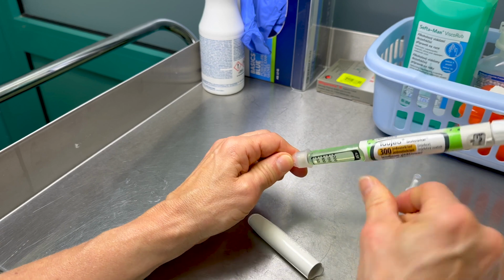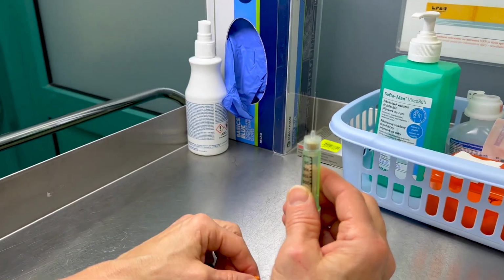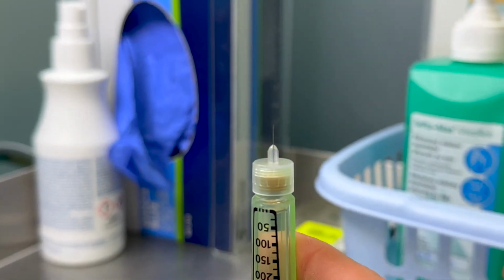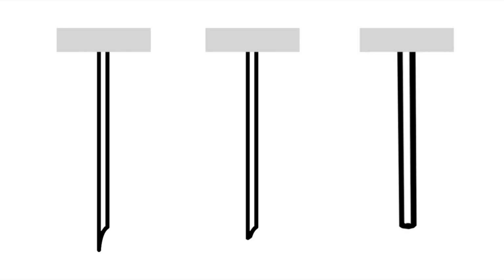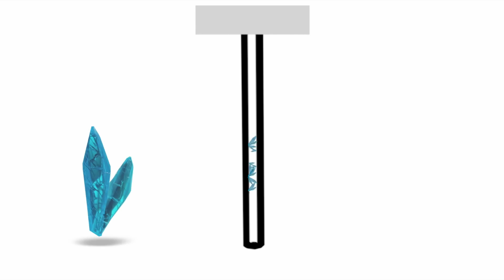Reusing needles carries several risks. After the first use, the needle becomes partially dull, making the injection more painful and increasing the risk of small injuries, bruises, and damage to the subcutaneous tissue. Injecting into hardened tissue can affect insulin absorption, leading to unexplained fluctuations in blood glucose levels. In such cases, it becomes difficult to calculate the insulin dose's effectiveness. Insulin may also crystallize inside the needle, potentially blocking it, which compromises the safe delivery of the insulin.